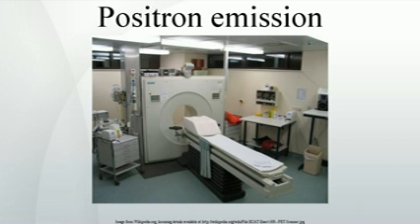In 1961, James Robertson and his associates at Brookhaven National Laboratory built the first single-plane PET scanner, nicknamed the head shrinker. One of the factors most responsible for the acceptance of positron imaging was the development of radiopharmaceuticals. In particular, the development of labeled 2-fluorodeoxy-D-glucose, 2-FDG, by the Brookhaven Group under the direction of Al Wolf and Joanna Fowler was a major factor in expanding the scope of PET imaging.